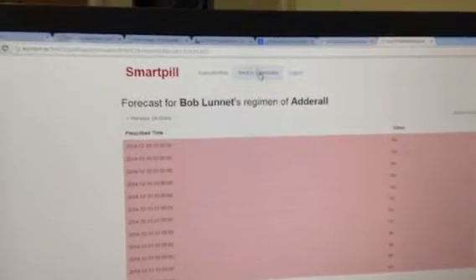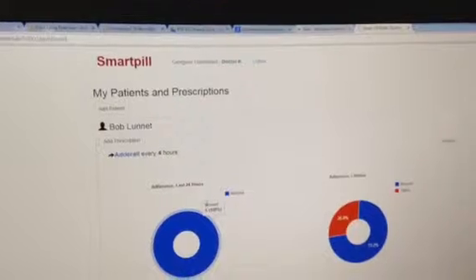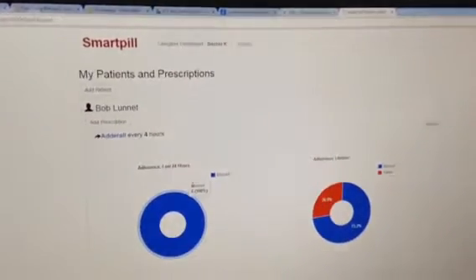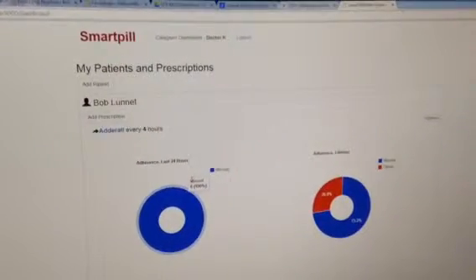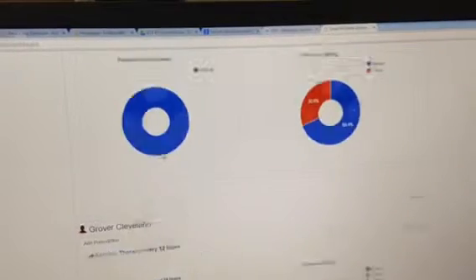Right now we're storing all of this in a SQLite 3 database, and the way that it goes from the Android application, which gets the taken signals, to our server here is through a REST API, essentially just sending URLs and JSON objects to communicate with it.